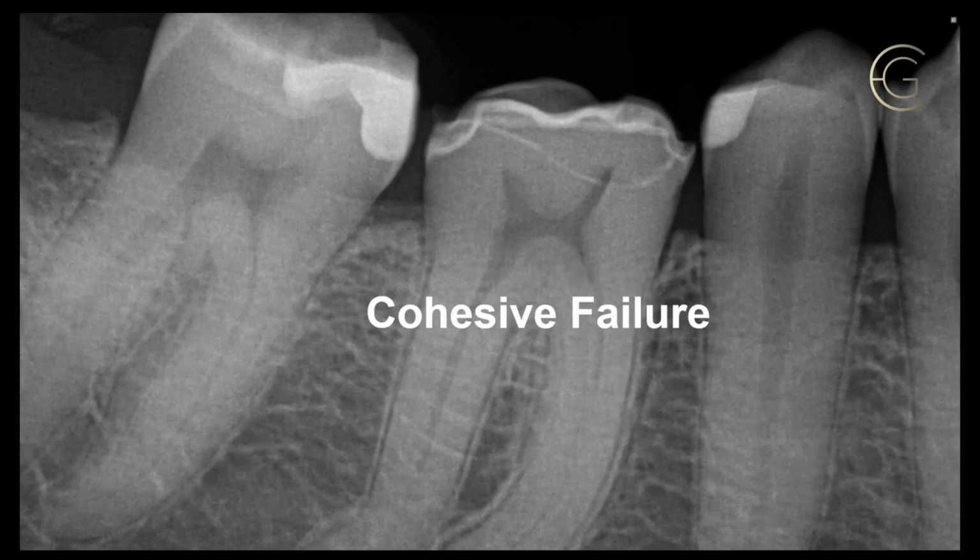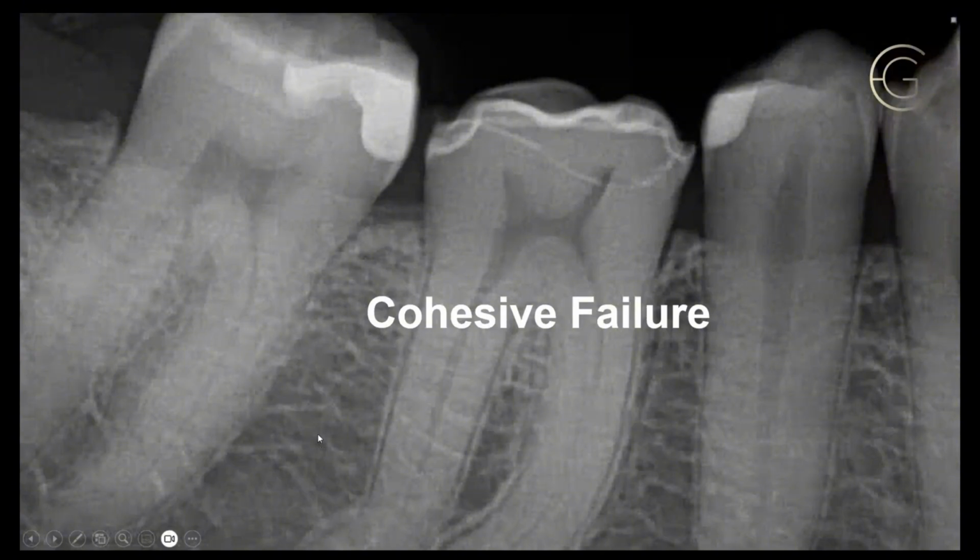So when somebody says they never have a crown or an onlay debond, I'm going to call BS on that, because we all have failures, and sometimes a patient never comes back to your office, so you don't know. But this patient called, and at 31, if your crown came off, how sensitive is this patient going to be? You know what? In this case, he had no sensitivity. We were able to schedule him at a time that was convenient for the office and not disrupt our schedule. And I took a picture of this with their permission.